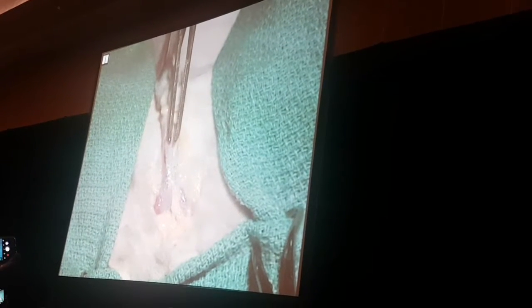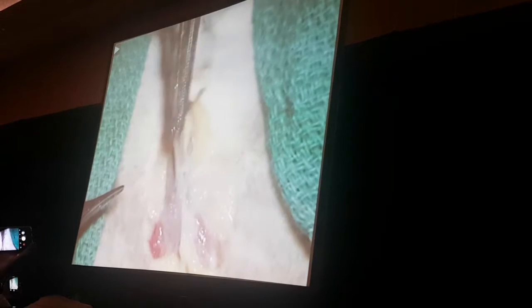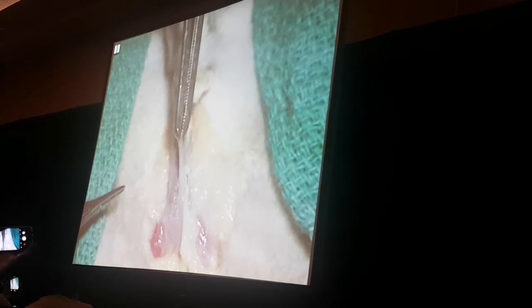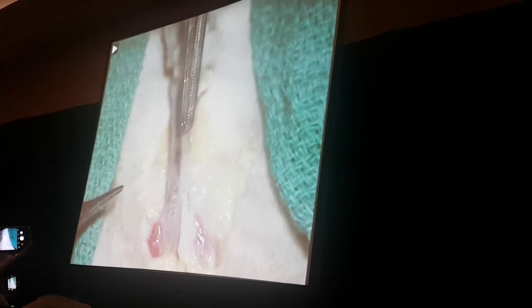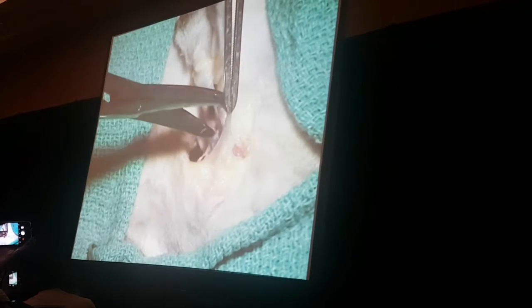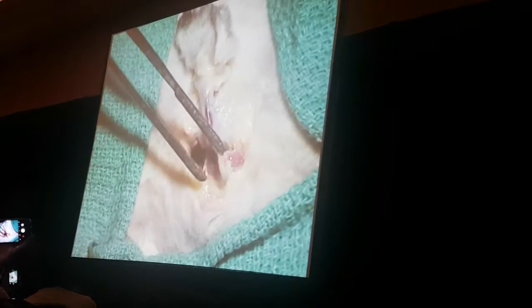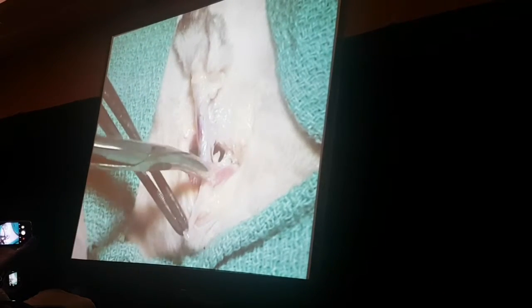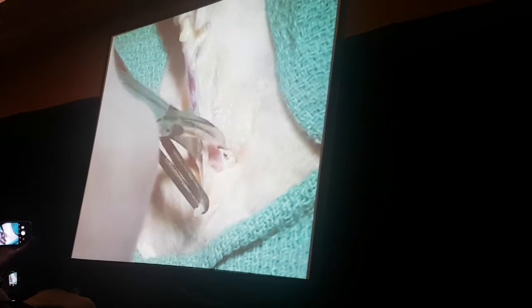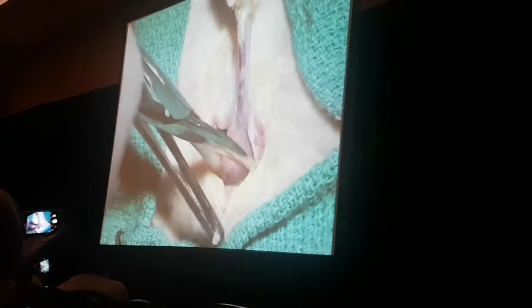Now we'll rotate the penis so that we're looking at the dorsal surface. You'll need to identify his retractor penis muscle, which is a small, white, little smooth muscle. Dissect it off of the urethra, and then begin your dissection dorsally following the plane that is established between the retractor penis muscle and the dorsal aspect of his penis.